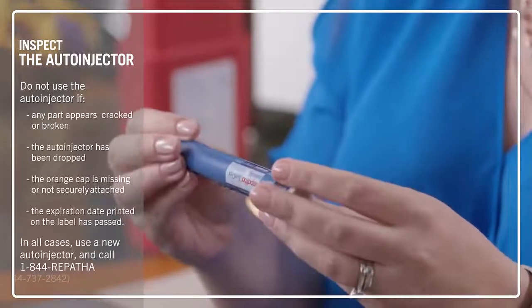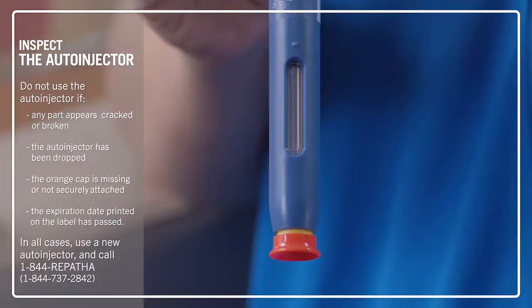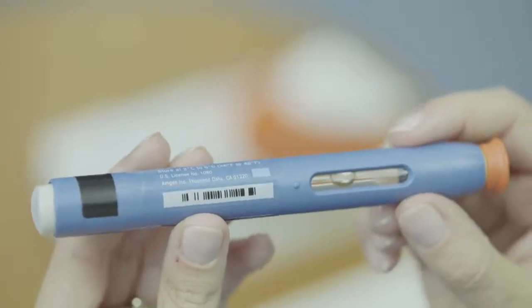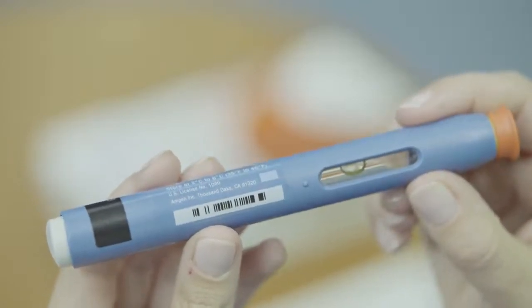Do not use the auto-injector if it has been dropped, if the orange cap is missing or not securely attached, or if any part appears cracked or broken. Inspect the window to make sure that the fluid is clear. Do not use the auto-injector if the medicine is cloudy, discolored, or contains particles. If it's slightly yellow, that's okay.